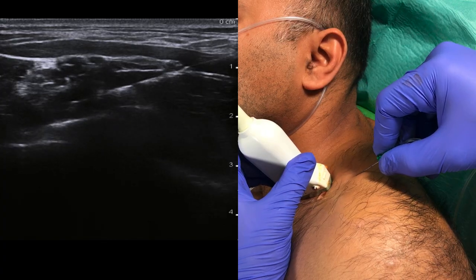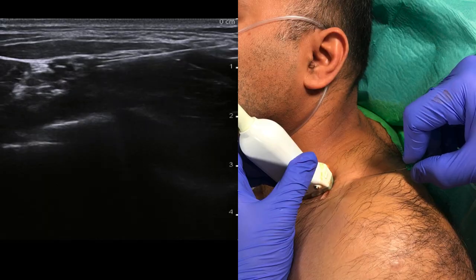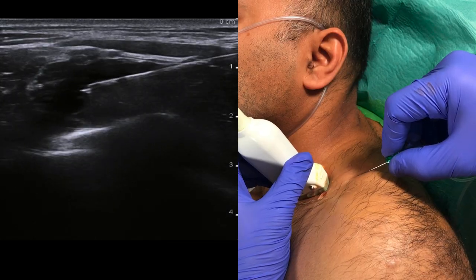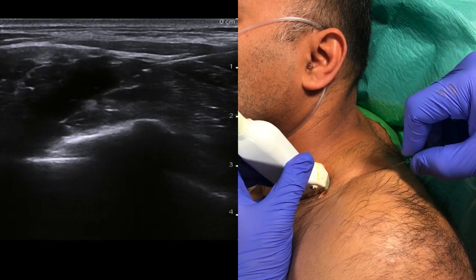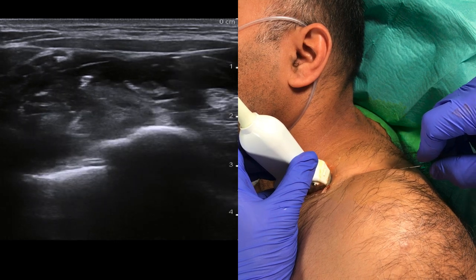We reposition the needle in order to see to it that local anesthetic is spread evenly around all branches of the brachial plexus. You may need to retract the needle a couple of centimeters in order to approach the plexus at a shallower angle in order to reach the shallower branches.